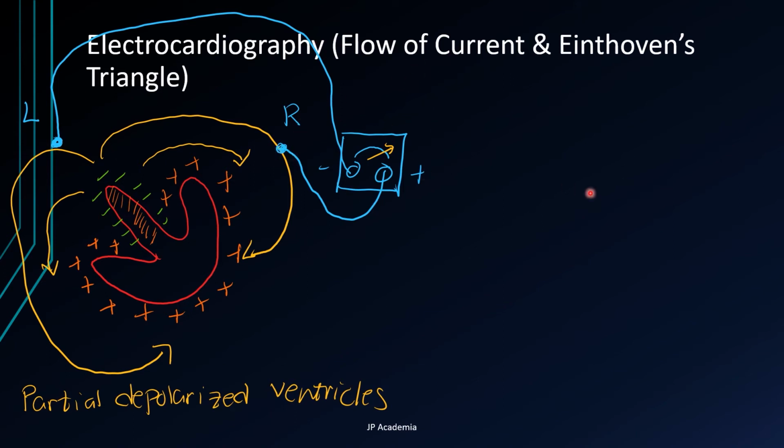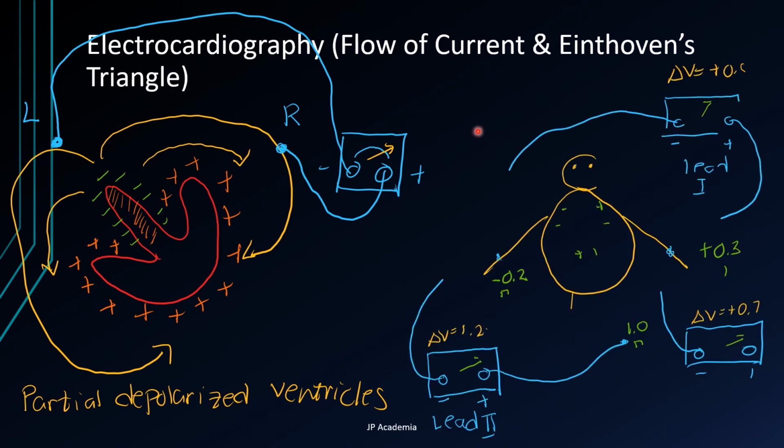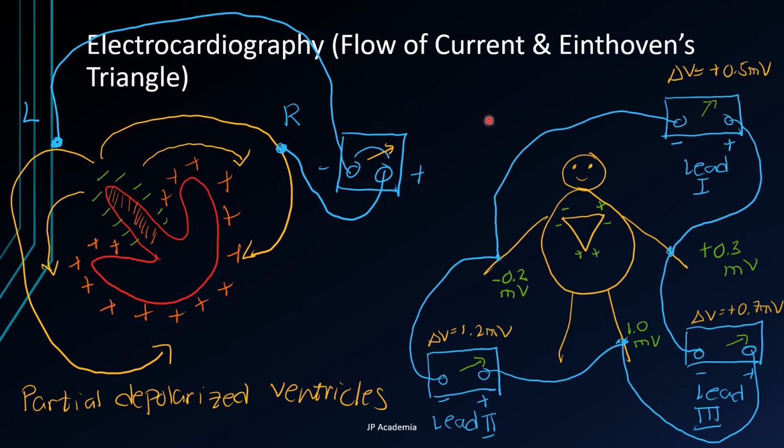On my drawing at the right, it shows the common arrangement of electrodes in standard electrocardiographic leads. Einthoven's triangle is superimposed on the chest area as well. This drawing also shows the bipolar limb leads, meaning recording from two electrodes. That's why it's called bipolar.